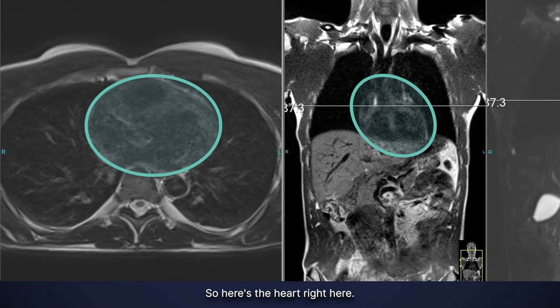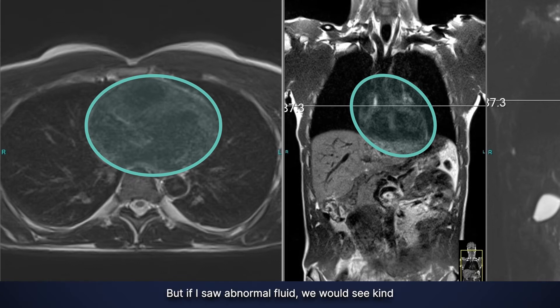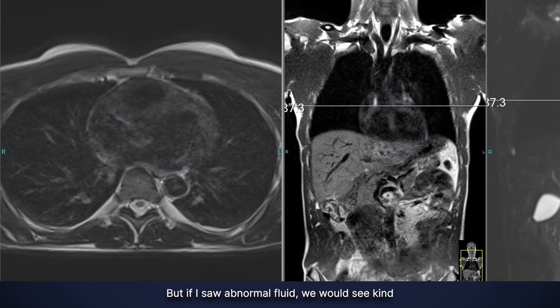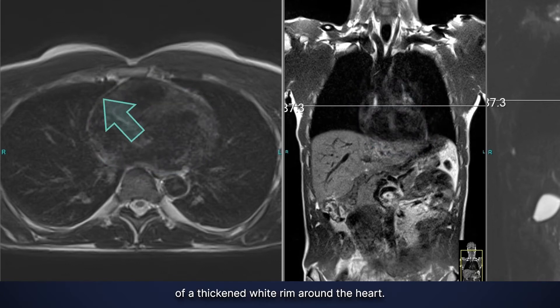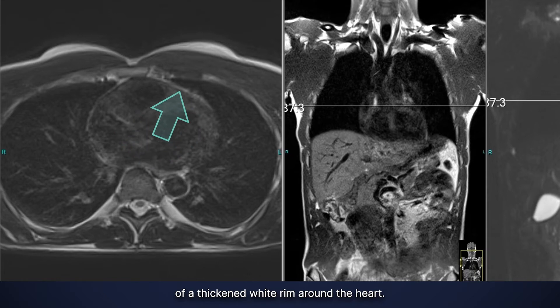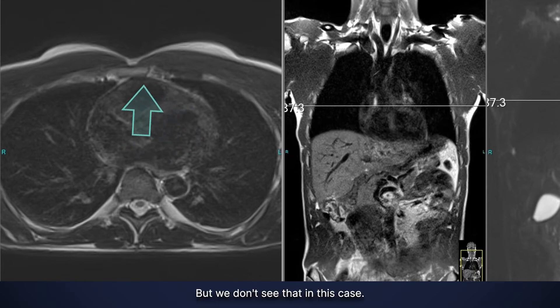Here's the heart right here — this is a normal size heart. But if I saw abnormal fluid, we would see a thickened white rim around the heart. We don't see that in this case.